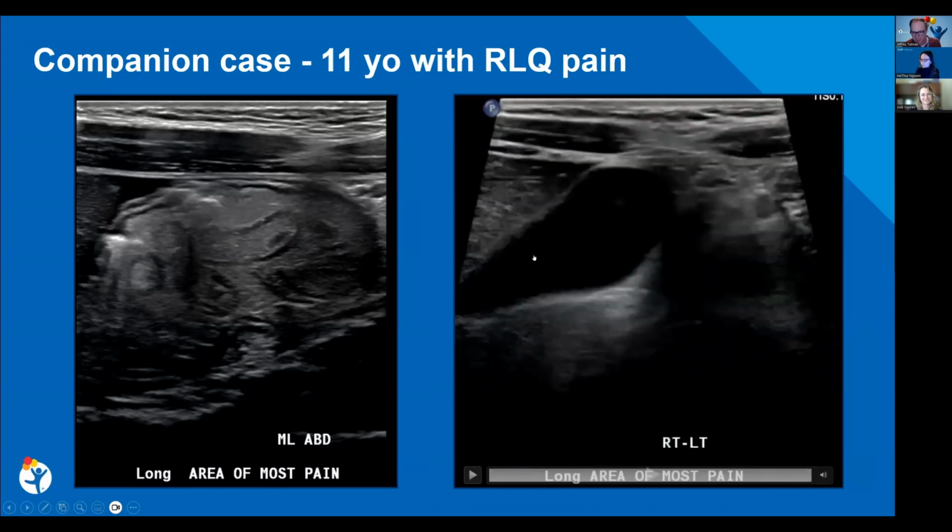So this patient just had a giant bowl of macaroni right before they came in for their ultrasound. So nothing pathologic in this case, just an interesting look at what normal macaroni looks like in your stomach.